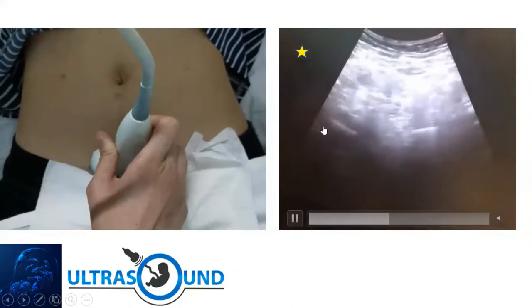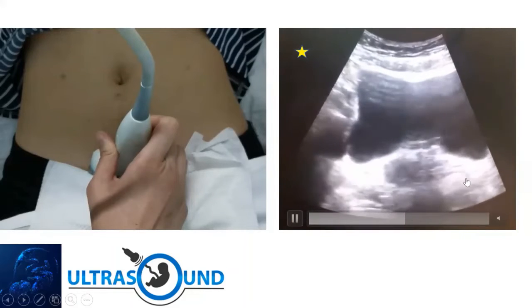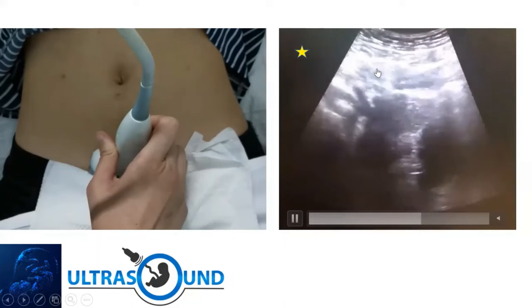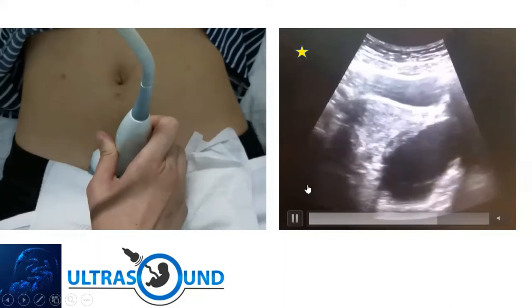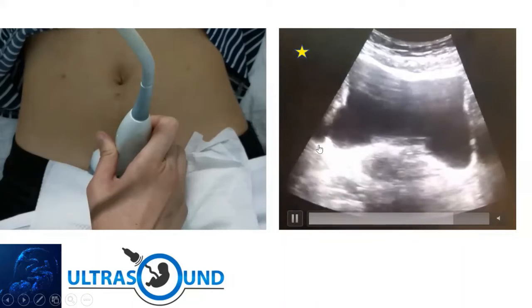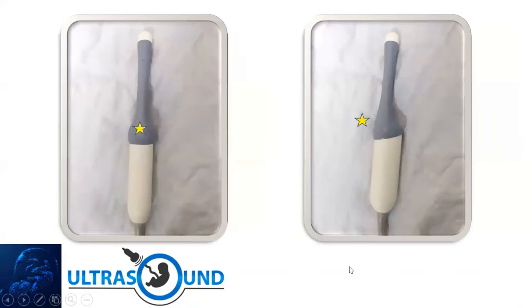Okay, so that is the patient's right looking at the marker, and that is the left. So there are abnormalities on the left. So I will still complete sweeping from the top to the bottom first and examine the uterus and then examine the adnexa. Then only I focus on this abnormal area. Okay, so always do it in a systematic approach.